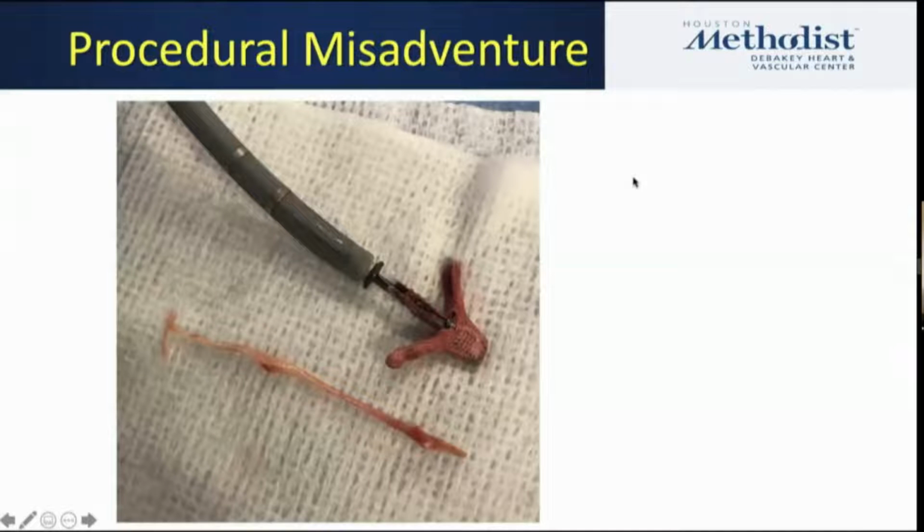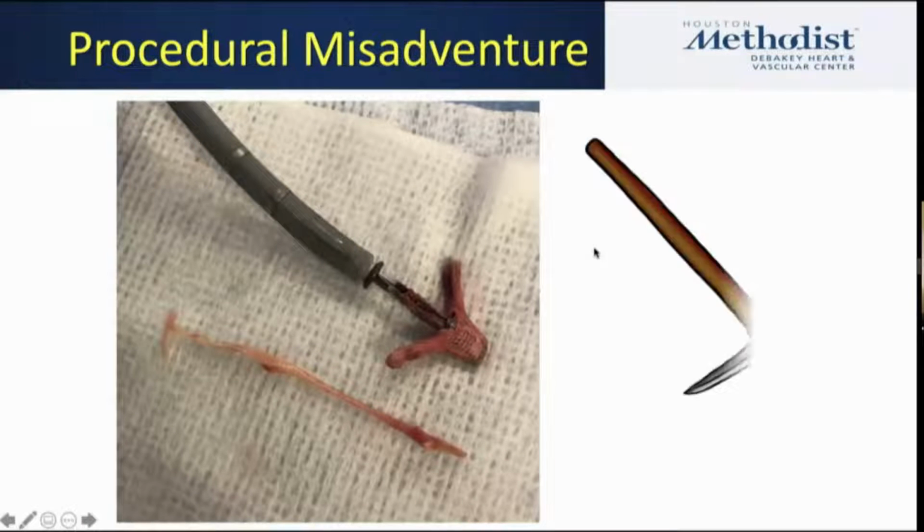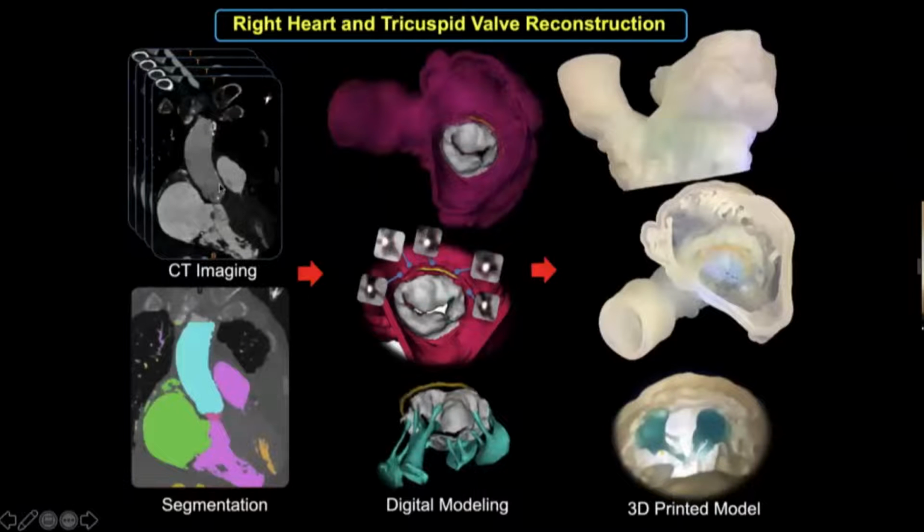This is one of the things we definitely want to avoid. This is a different patient. The tricuspid cords are generally not as strong or as robust as the mitral cords. A tricuspid clip looks a bit like an ice pick. And if you get into the cords and twirl around, you can get caught, tangled, and in fact, you can remove the device with a cord. And you don't really want to do this chordal biopsy. This makes the TR worse. So recognizing that chordal entanglement can be a very real concern, you want to be maximally informed before you do these procedures.